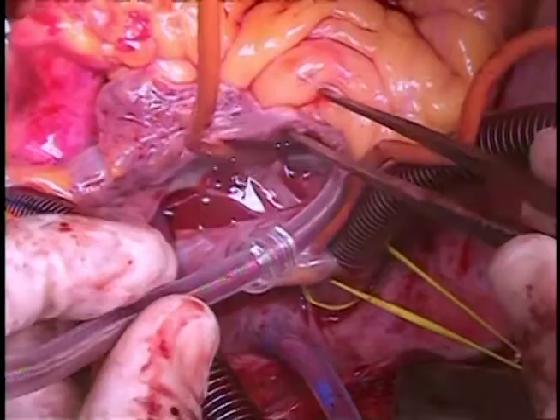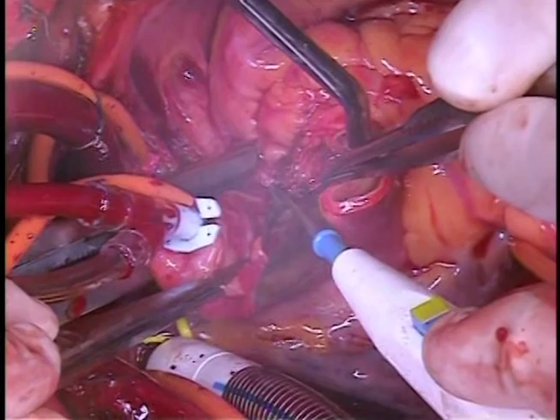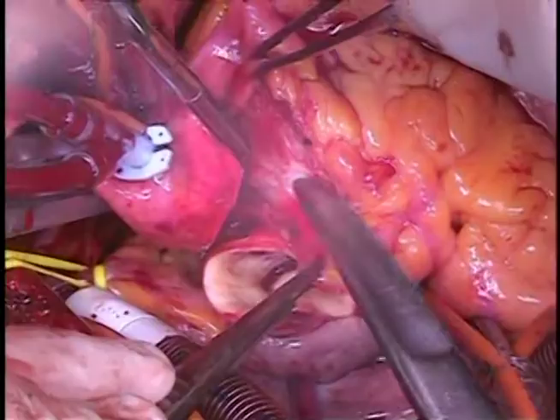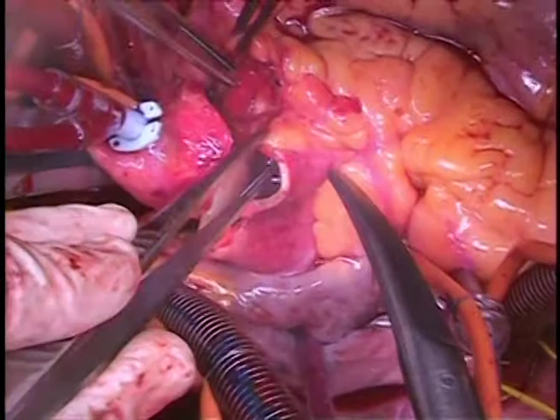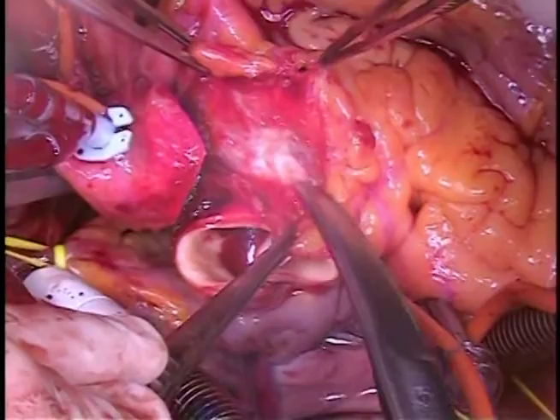Once the heart is arrested, we make a standard aortotomy above the sinotubular junction and transect the aorta. We begin the subannular dissection at this point using the rim of the sinotubular junction aortic tissue as a handle. We start by peeling the PA off the aorta and left main coronary artery, continuing anteriorly to the right coronary artery.